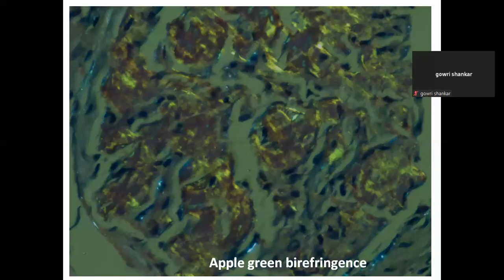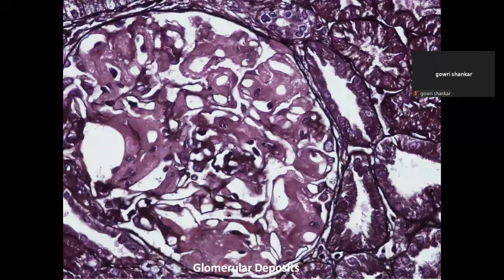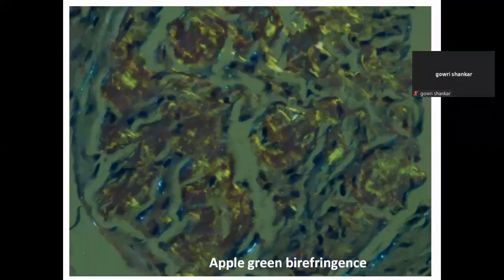But now you need to categorize this amyloid, whether it is primary or secondary. So why is this under the mimicker pattern? Just look at this glomerulus. That is why I brought this under a differential of the pattern of glomerular injury. Just compare this membrane with this membrane, or maybe this membrane, or this membrane. So there is a non-uniform thickening. There is a mesangial expansion. So there is some kind of a membranoproliferative pattern which is there.